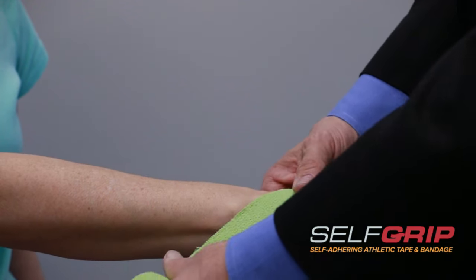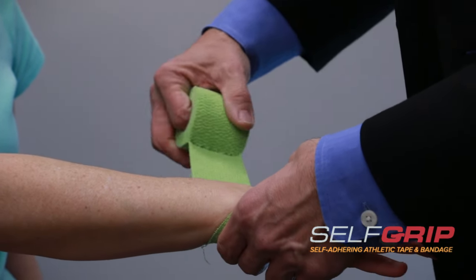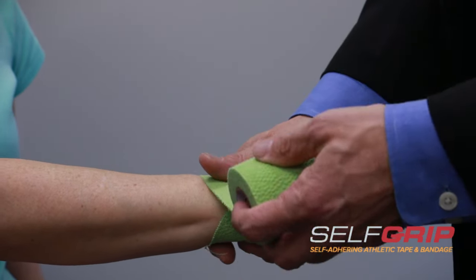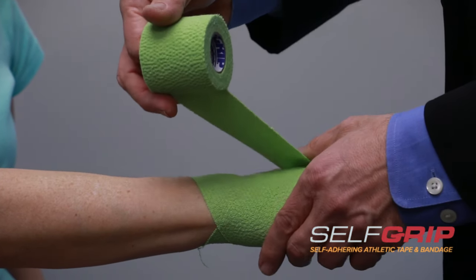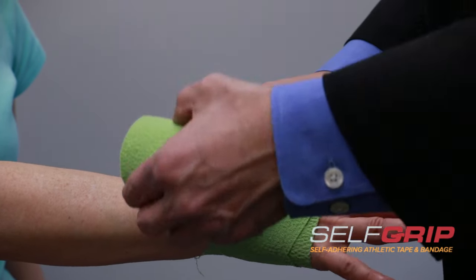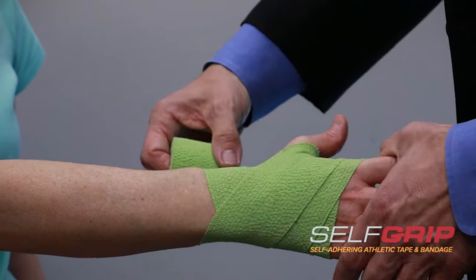In this particular case, we're going to do what we call a figure eight. We're going to come across the wrist and come down. Make sure the thumb is spread nice and wide and overlap by about a half or a third. You want to minimize any wrinkles so there's no chance of developing a blister.